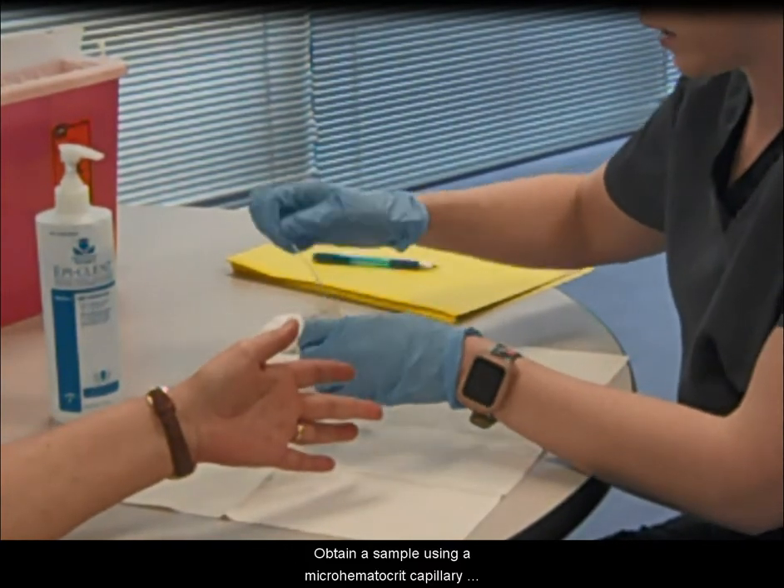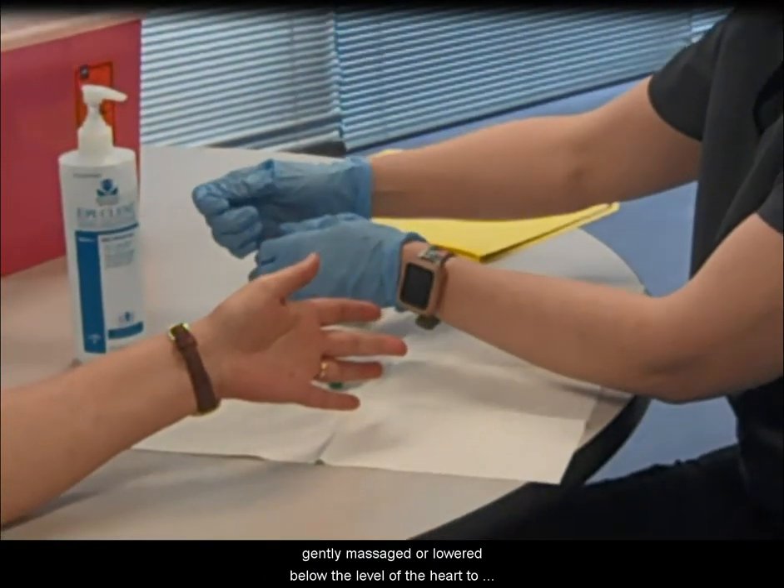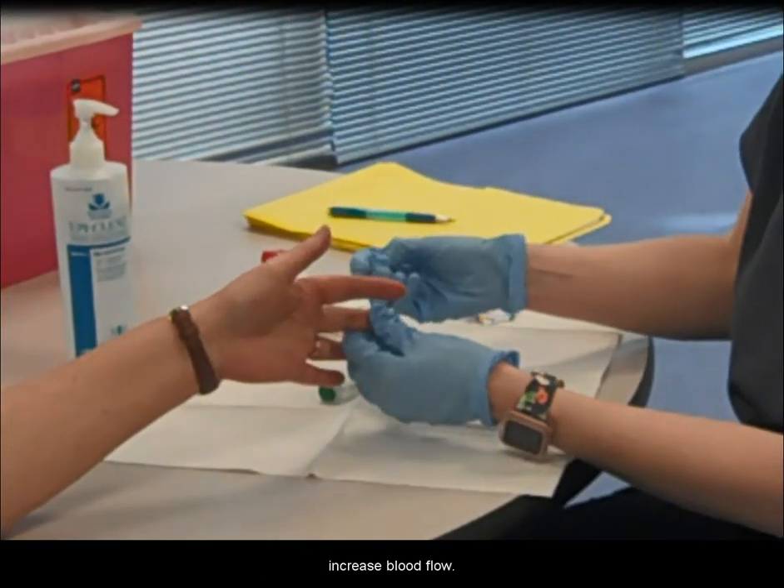Obtain the sample using a micro-hematocrit capillary tube. The finger or foot may be gently massaged or lowered below the level of the heart to increase blood flow.